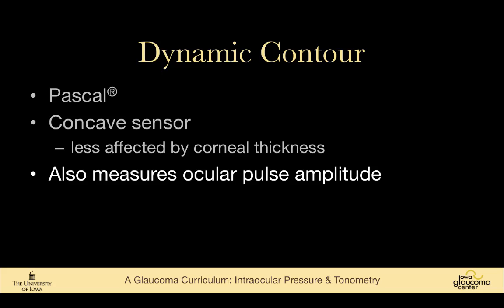It's rather expensive, and I think the reality of intraocular pressure is, and this will sound heretical, that the precise pressure is less important than the pressure in an individual. For example, if you know that somebody is getting worse at a pressure of 22 measured on a Goldmann tonometer, it really doesn't matter if their actual pressure is 24 or 20.